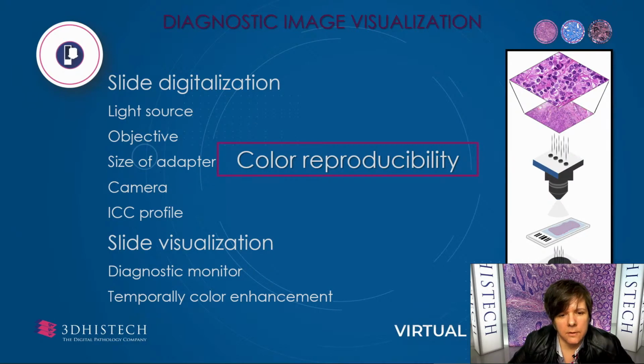In the diagnostic field, color reproducibility is the most important issue regarding slide digitalization. The same optical path and illumination structure are not enough for producing the same visualization experience. The International Color Consortium, or ICC profile, must be identical for both scanners when scanning slides, and we must go further. A diagnostic monitor is also needed. There are some monitors on the market that have IVD certificate. We pay special attention to proper color calibration.